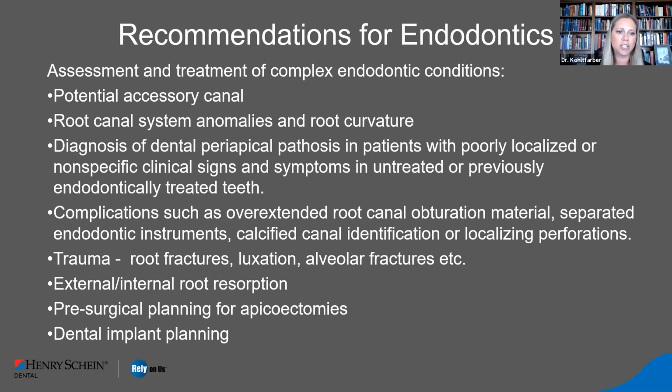Some other recommendations of when you could take it. So these are, when you want to do it. Potential accessory canal, if you're concerned about an accessory canal. If you're concerned about any type of anomaly or root curvature, if you need to be able to better diagnose your periapical pathologies, or if there's poorly localized, non-specific clinical signs and symptoms in untreated or maybe a previously treated tooth. Complications such as overextension of your obturation material, separation of any type of endodontic instruments, a calcified canal, any type of trauma.